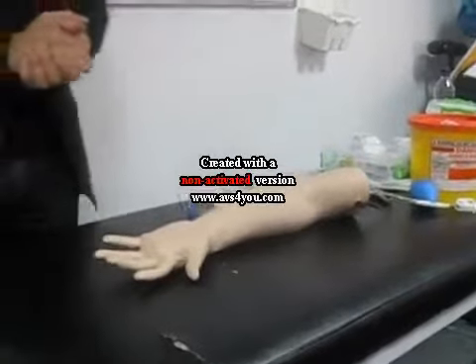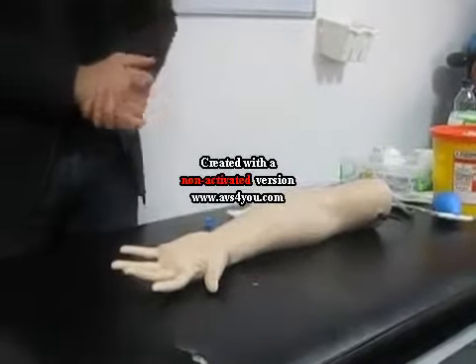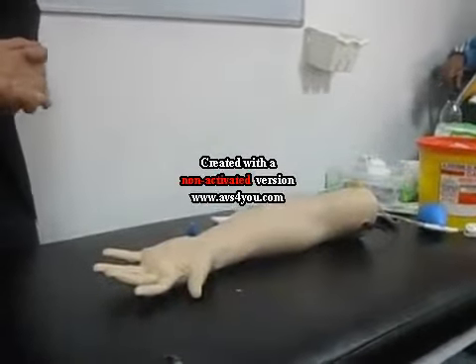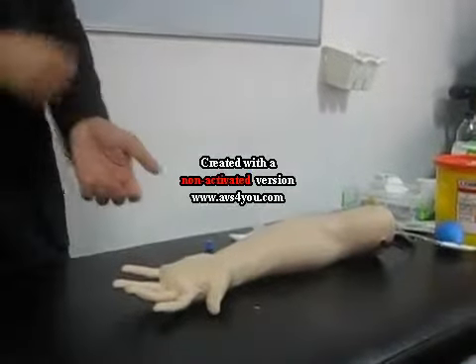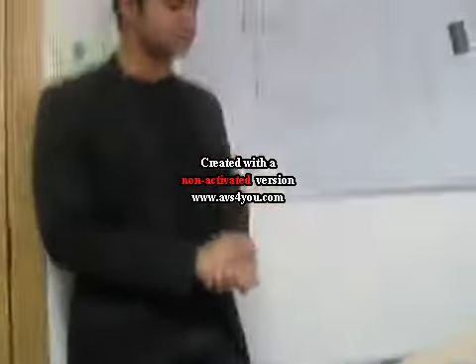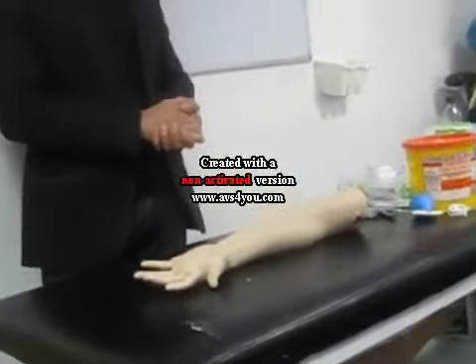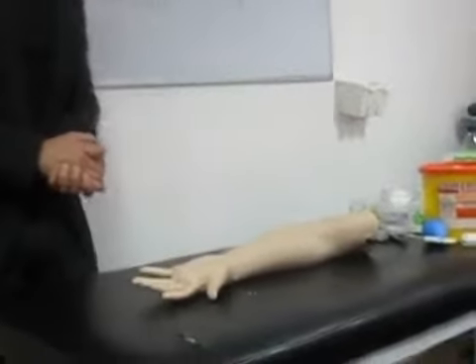Right, thank you. In a real scenario, first of all, I'll greet my patient and check the identity of my patient. I'll introduce myself and tell him that the purpose of my visit is to collect some blood from the deeper channels of his arm and his hand. I'll ask him for any arm preference, any arm soreness. I'll ask him to roll his sleeve up, offer him privacy and request a chaperone. I'll warn him that if I do not succeed in this first attempt, I might have to repeat the procedure, and that he will feel a sharp scratch during the procedure.